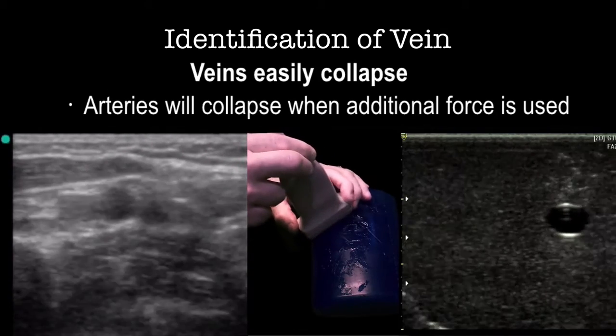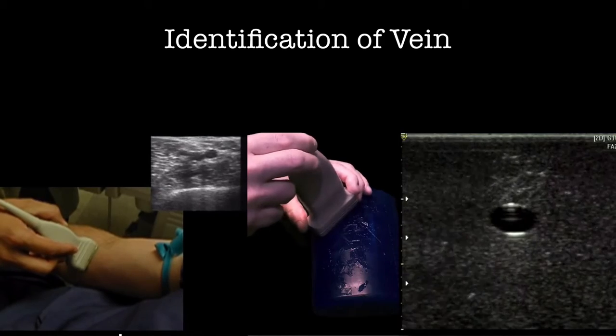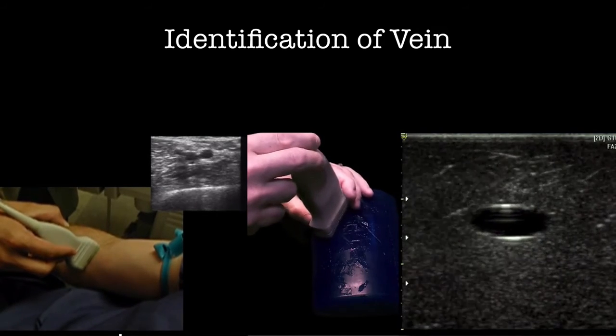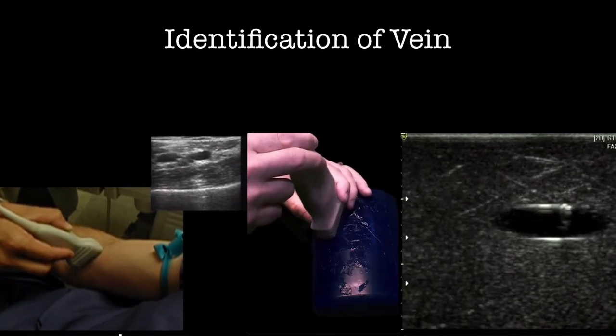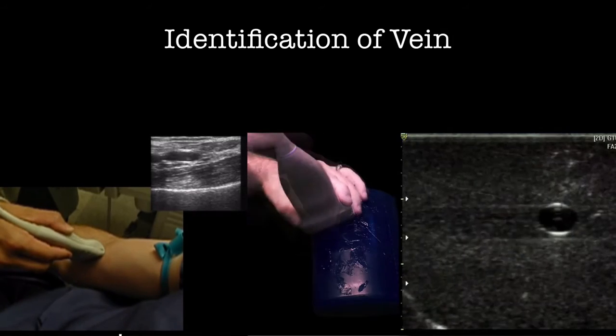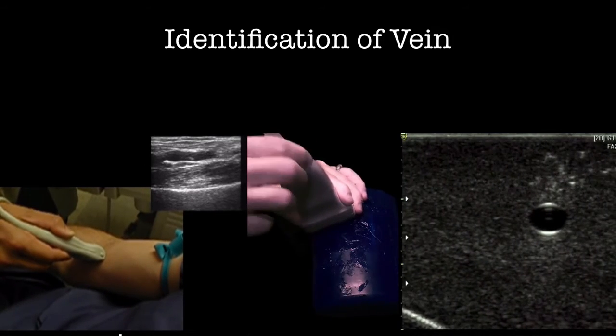Veins are not identified in long axis. Veins are identified in short axis and then the transducer is turned from short axis to long axis while visualizing the vein on the screen the entire time.